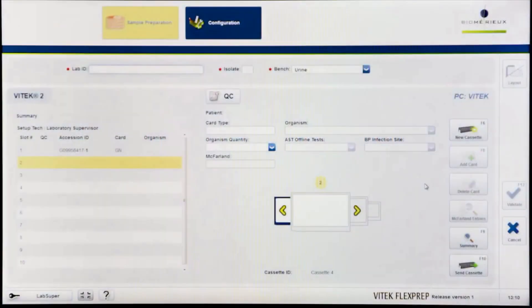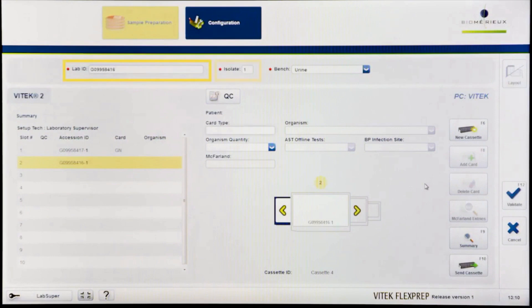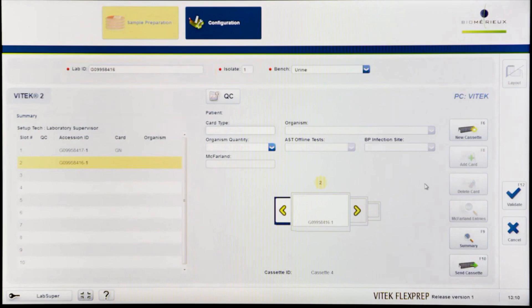When entering ID cards with one or more AST cards, enter the lab ID and isolate number. On the cassette definition screen, enter the card barcode number of the ID card either by scanning the barcode number or by entering it manually.